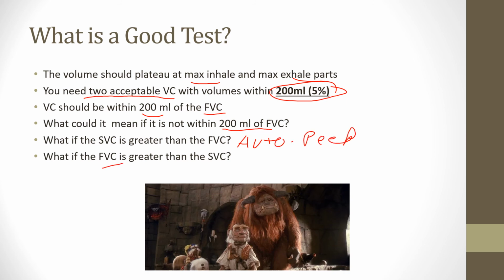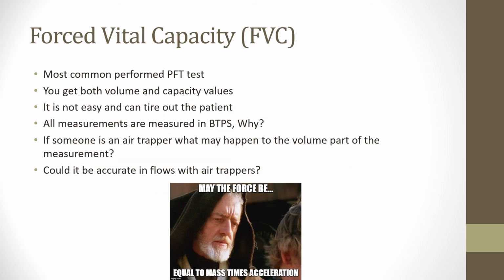If the FVC, the forced vital capacity, is greater than the SVC, then the patient effort on the SVC was very poor, so that's a retest of the SVC traditionally. All right, so hopefully you got that all down.